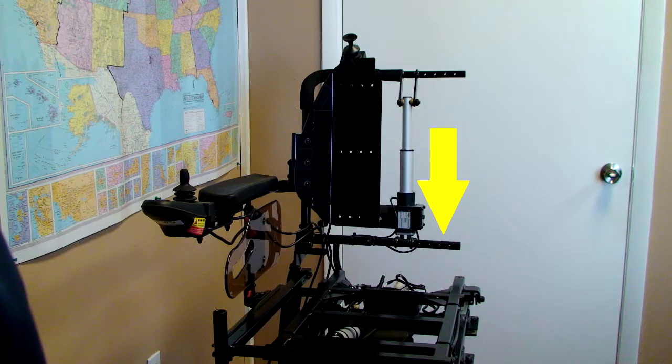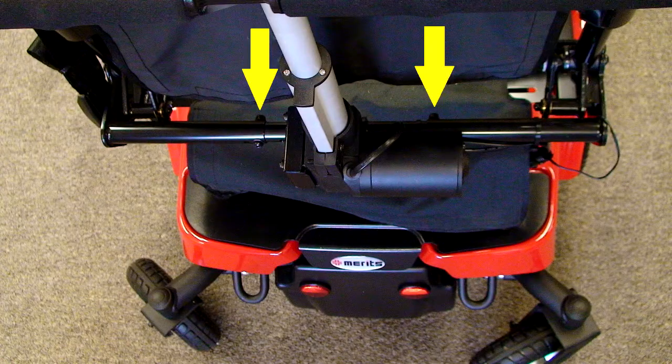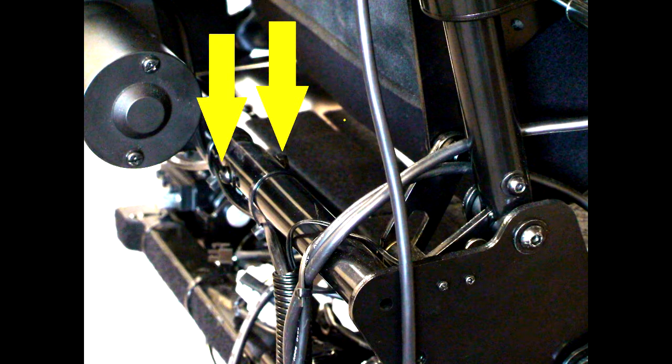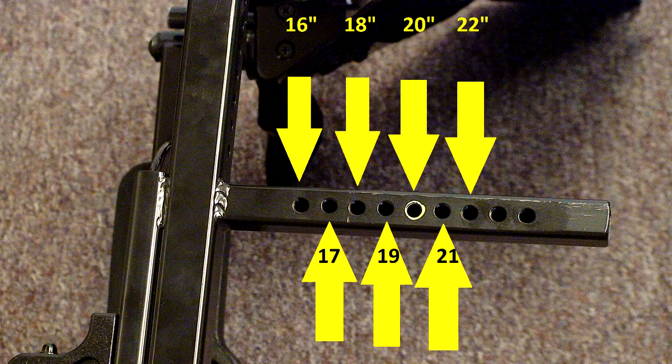Next we'll do the lower back, which is pretty much the same as the top of the seat handles. There are four holes on each side of the center bar and two on the outside bars. For 20 inches, go to the third hole out from center and the hole closest to the end on the outside frame. Adjust the lower back to align to the proper holes and install the 4-millimeter allen bolt, washer, and 10-millimeter nut. Now adjust the underneath of the seat base in the rear to align the proper hole and install the 5-millimeter allen screw. Adjust the front and do the same thing in the same hole. At this point, repeat all the steps we did for the right side for the left side.